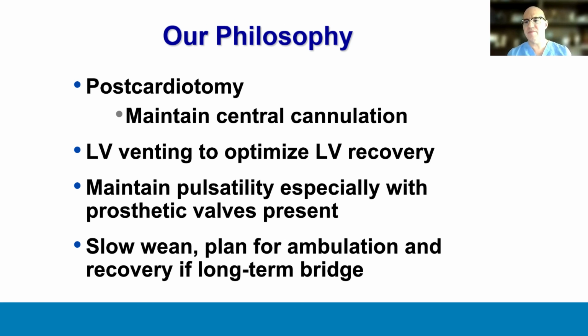LV venting to optimize LV recovery. If you have LV distension, you're not going to have LV recovery. That's the bottom line. If there's some intrinsic LV function, we do suggest maintaining pulsatility, especially in a patient where prosthetic valves are present. Because we've had thrombosis of even bioprosthetic valves, but certainly if there's mechanical valves present, you want to flow optimally to maintain pulsatility. And then you want to plan for a slow, deliberate wean. If you put on post-cardiotomy ECMO, do not be in a hurry to get off the ECMO in 24 or even 48 hours of support.